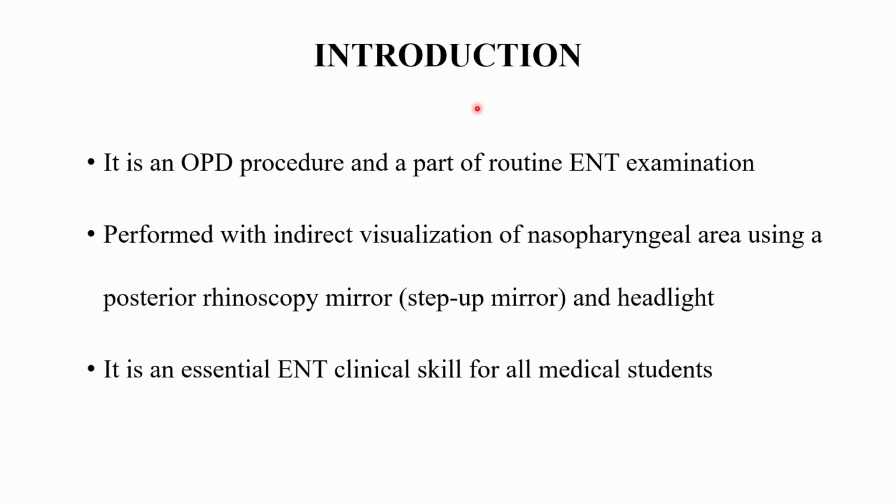For introduction, posterior rhinoscopy is an OPD-based procedure and a part of routine ENT examination. It is performed with indirect visualization of the nasopharyngeal area using a posterior rhinoscopy mirror. So the name of the instrument is the posterior rhinoscopy mirror. Again, not the posterior rhinoscope, but the posterior rhinoscopy mirror, or the step-up mirror. You should remember that for indirect laryngoscopy, the mirror is a straight mirror.